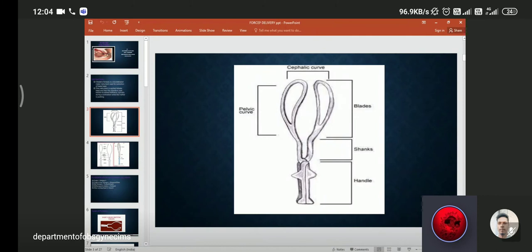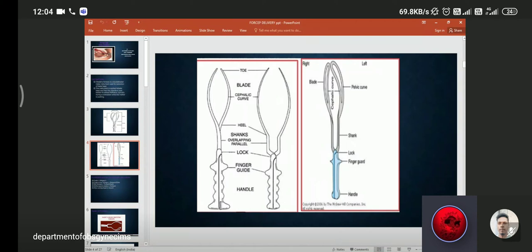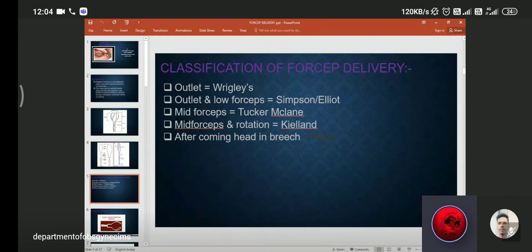These are the two types: outlet and mid cavity forceps. The long one is mid cavity forceps and the small one is outlet forceps, also known as Wrigley forceps. Then outlet and mid forceps, that is Simpson or Elliot forceps. Third one is mid forceps, that is Tucker or McLean forceps. Mid forceps and rotating forceps are Kielland, and after coming head of breech is removed by Piper forceps.